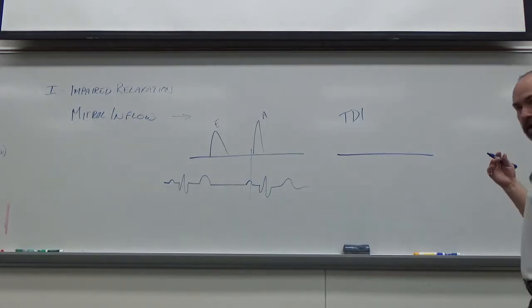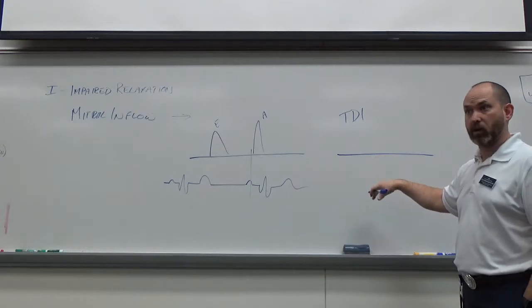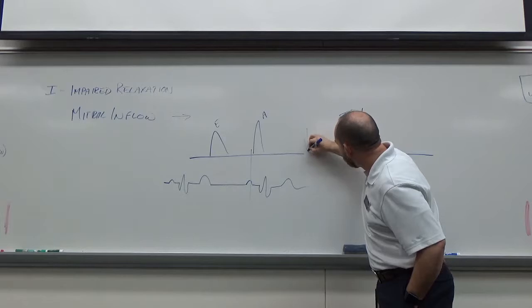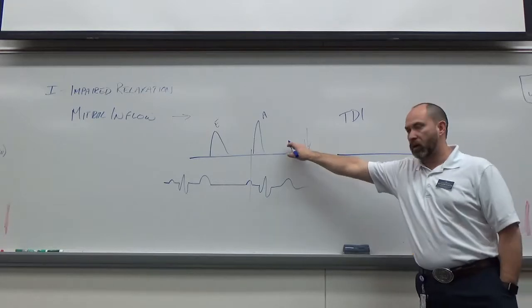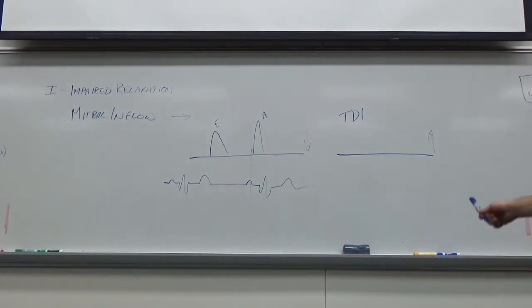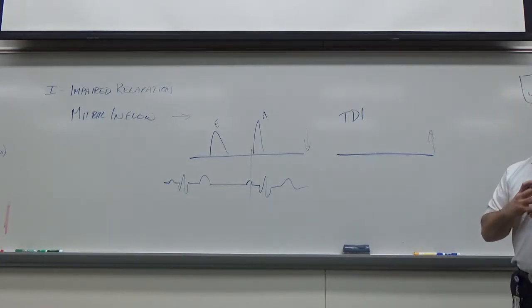On a transthoracic echo, these are always going to be below baseline as our waveform, so we're going to move the baseline up. I'm going to put this one's baseline down, this one's baseline up, near the top. What about velocity? This is up around 100 to 120 centimeters per second. What would I expect on velocities for tissue Doppler?